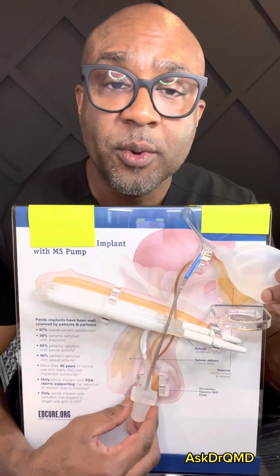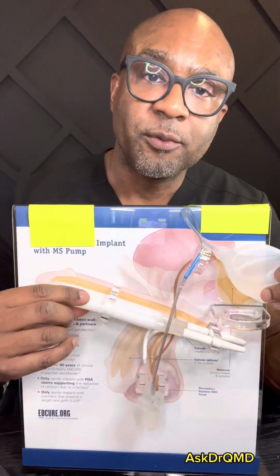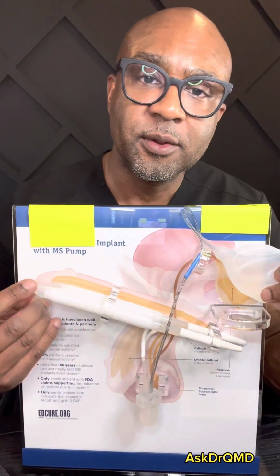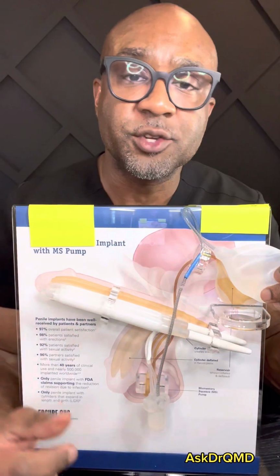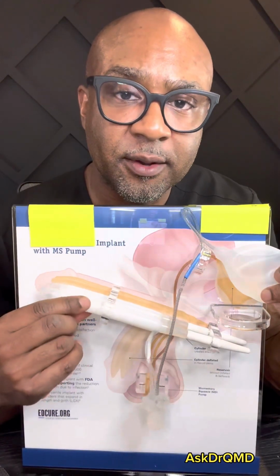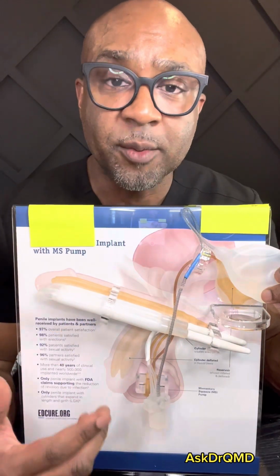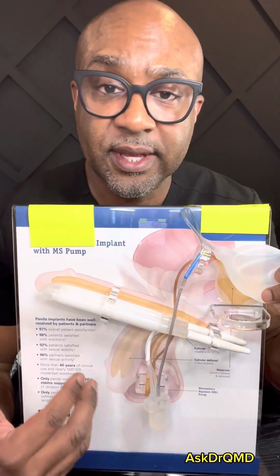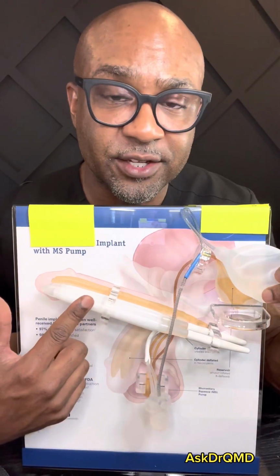And so when you are done pumping, you have a rigid prosthetic here with a rigid tip to help with the penetration, but it's actually not as rigid here as it is on the tip, okay? So what your partner feels is actually you. It's a warm erection. They don't feel any of this inside, internally.